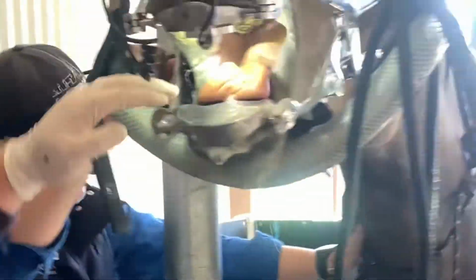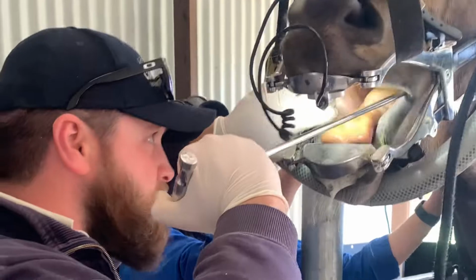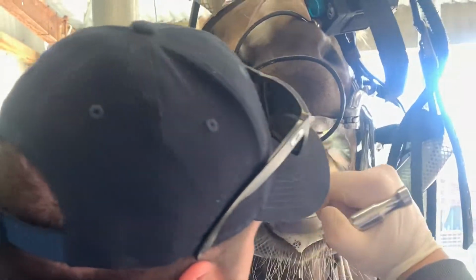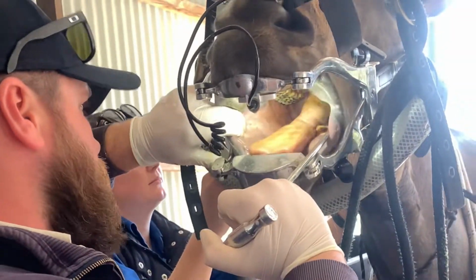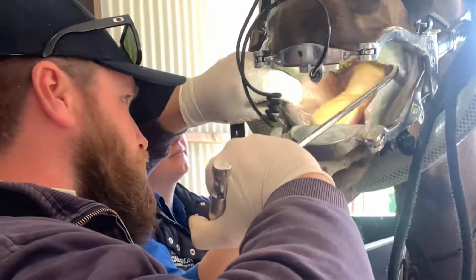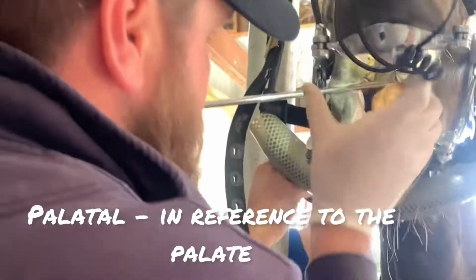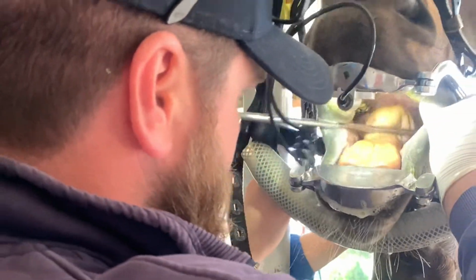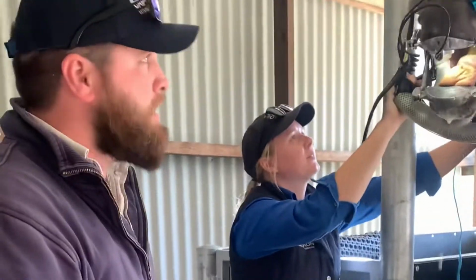Awesome. So now we're in. We're not really expecting to find too much in a young horse like this, but there are still very many conditions that you will find, including eruption. But this horse has been done fairly regularly. So what we want to do is run our mirror down the entire mouth, make sure that we're having a look at both the outside or the buccal side of the tooth, and then we have a look at the inside of the tooth or the palatal side of the tooth, and making sure that we can see if there's any sort of disease or pockets going along. And then we have a look at the actual flat surface or the grinding surface of the tooth. Now we've got to do that in all 4 arcades, and that takes time.